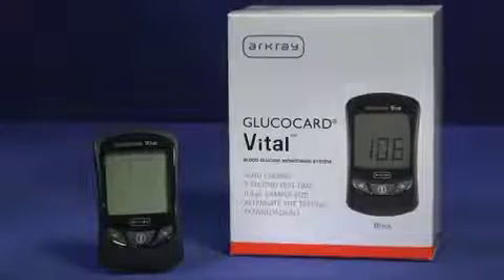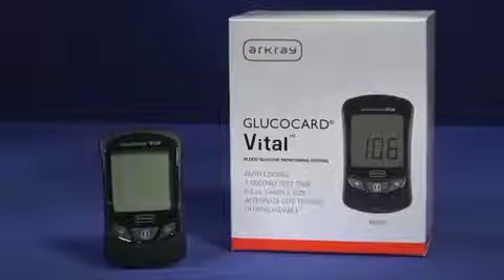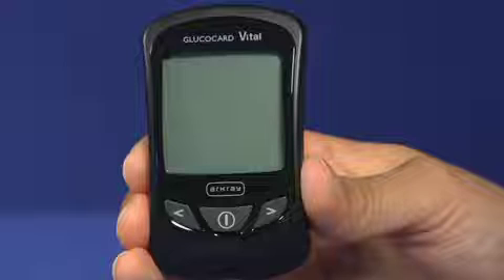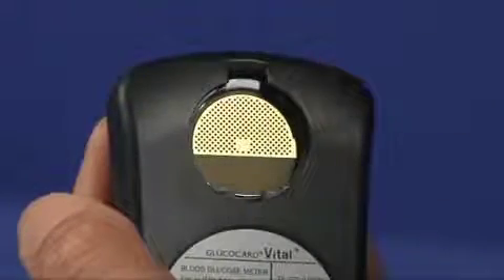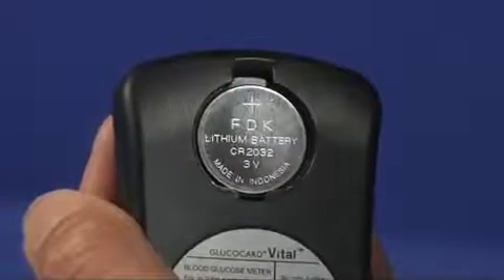Although your Glucocard Vital Meter comes with one 3-volt lithium battery already installed, you will need to change it from time to time. To do this, make sure the meter is turned off. Remove the battery cover by pulling the cover tab up with your finger or fingernail. Remove the old battery and dispose of it. Insert a new 3-volt lithium battery with the writing facing up, and replace the battery cover.